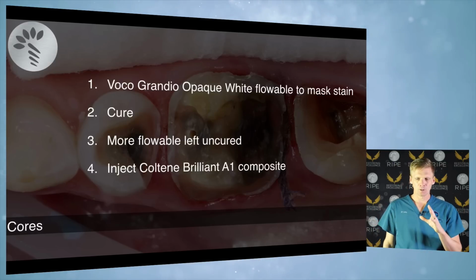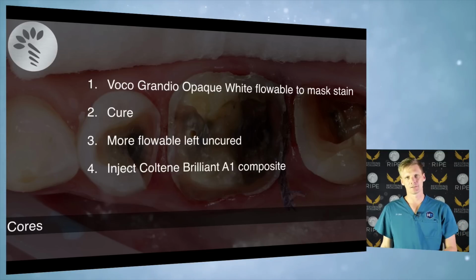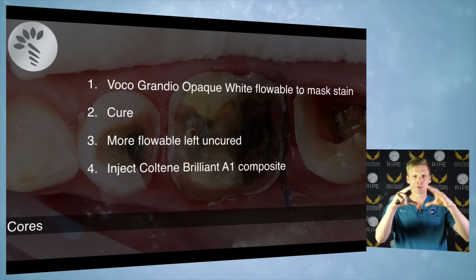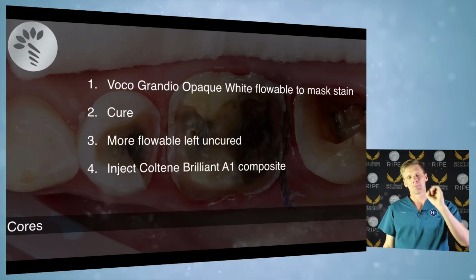Now, it doesn't take very long, so you need to control everything for about 30 seconds, 40 seconds to do this. It is fairly quick. And then you just use a microbrush, or you can use a flat plastic, or you can use your finger, but you just want to shape it to a giant blob. I'll go through this step by step in a moment. And then you cure.